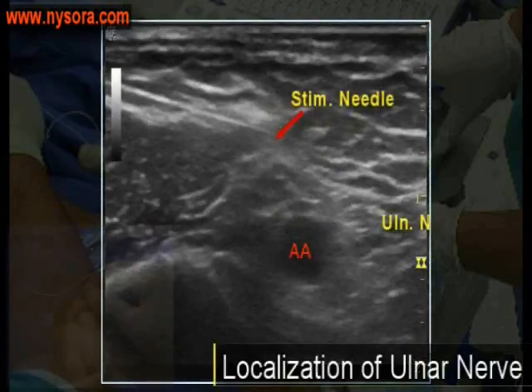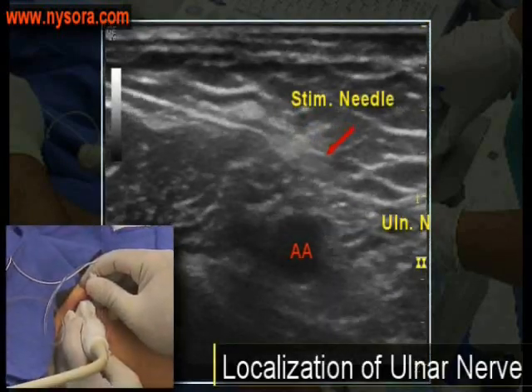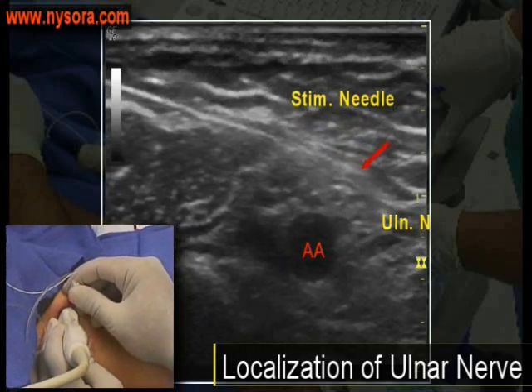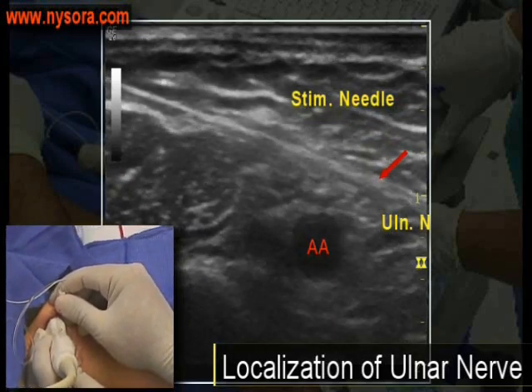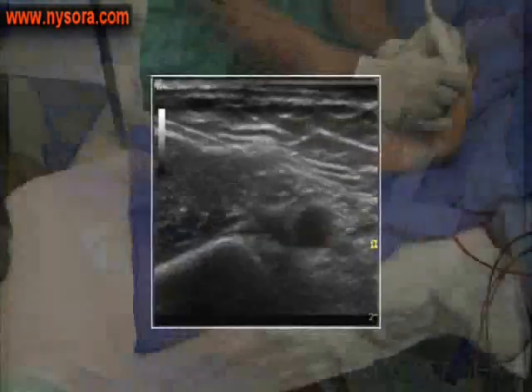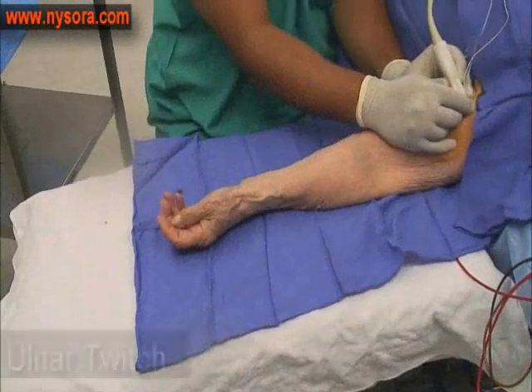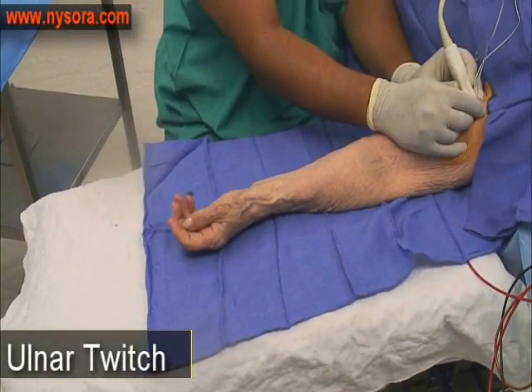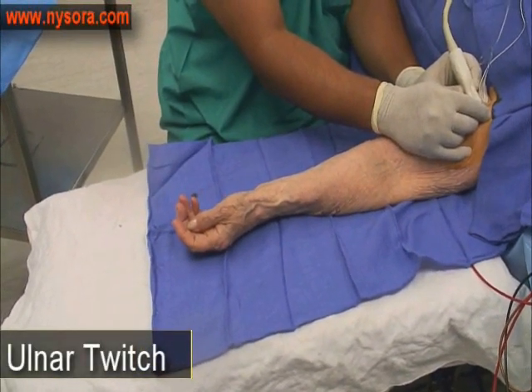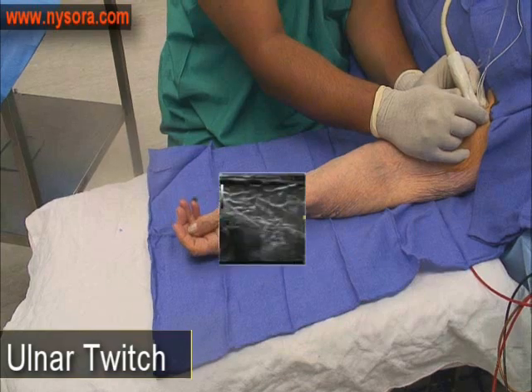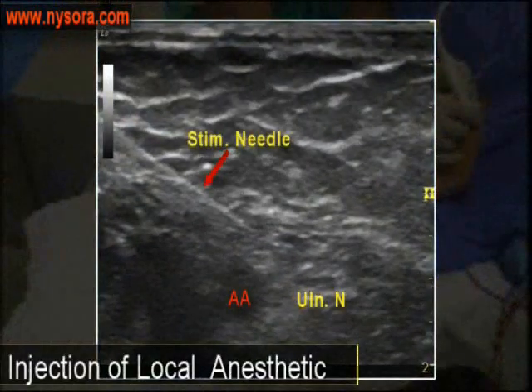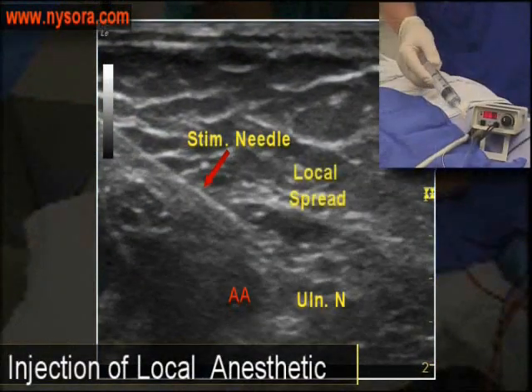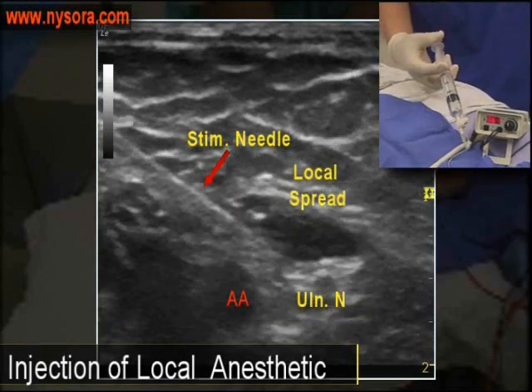This sequence shows the needle approaching the ulnar nerve. A motor response can also be elicited. Local anesthetic is then injected near the ulnar nerve.